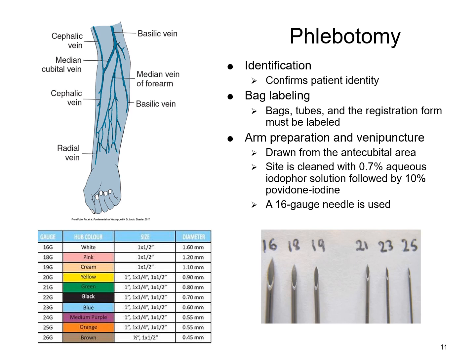And of course, one of the more important parts, though every step is pretty important, is making sure that you keep your process sterile, as well as making sure the identity is correct, because you need to be able to trace that unit of blood back should an issue arise, and making sure that it's properly labeled.